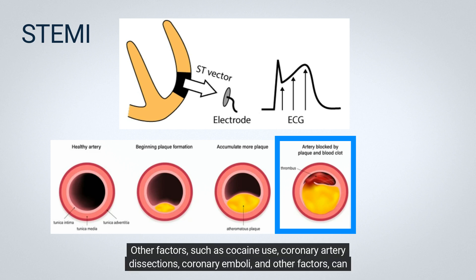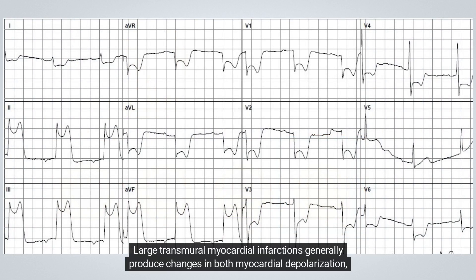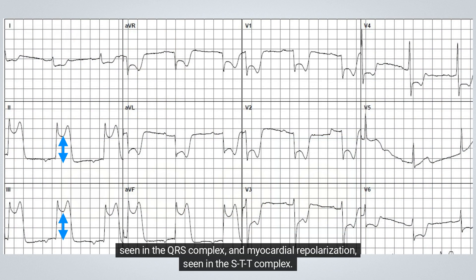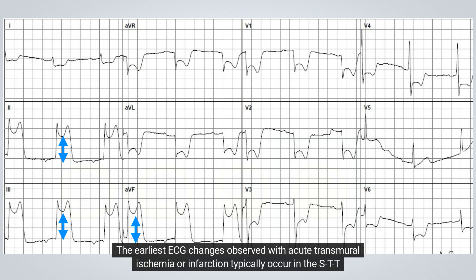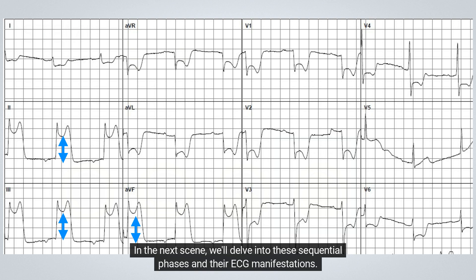Other factors, such as cocaine use, coronary artery dissections, coronary emboli, and other factors, can also cause or contribute to acute STEMI. Large transmural myocardial infarctions generally produce changes in both myocardial depolarization, seen in the QRS complex, and myocardial repolarization, seen in the STT complex. The earliest ECG changes observed with acute transmural ischemia or infarction typically occur in the STT complex and sequential phases. In the next scene, we'll delve into these sequential phases and their ECG manifestations.